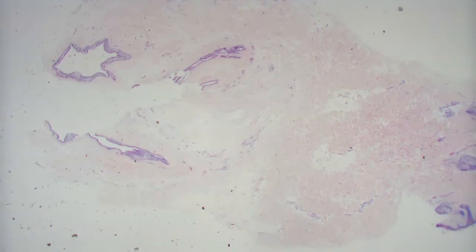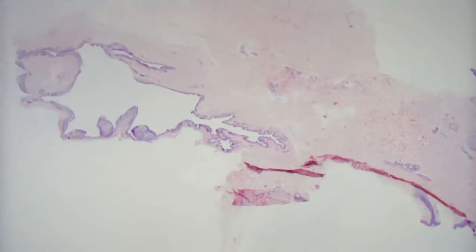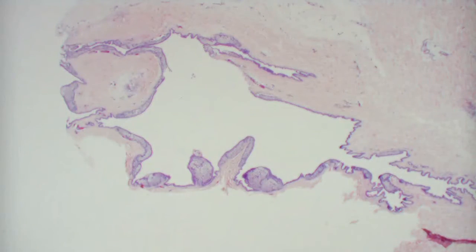All right, number 43. We're doing pretty good on time, I think. This was a punch biopsy, and the main pathological finding I was drawn to was the lower part of the biopsy, the deep dermis. In one of the cuts there's a very large open space with a real jagged pink lining that I called a shark tooth lining. So I was going for a steatocystoma.